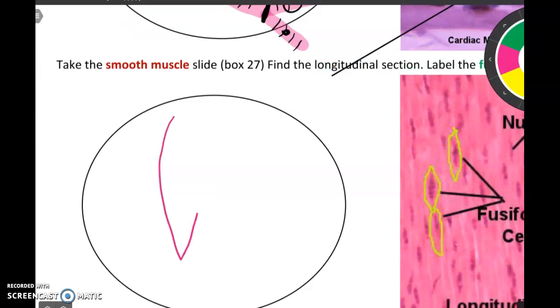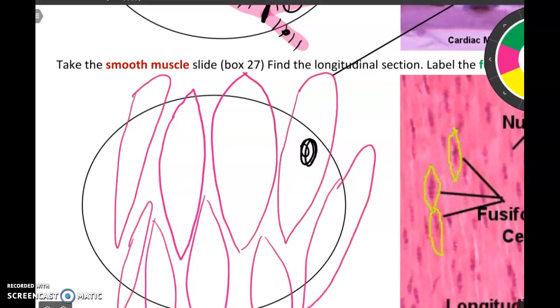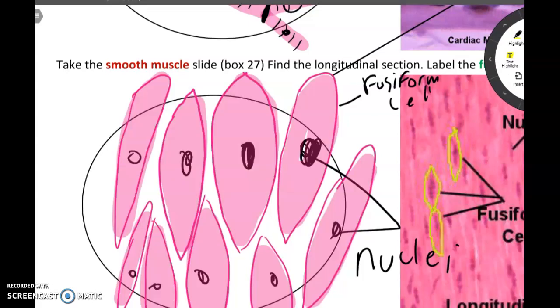Now in the face-to-face class, I tell my students, make your drawings big so you are not drawing that much. Nobody ever believes me. So I'm making these nice and large. So there are these tapered cells with a central nucleus. So there, the central nucleus. And just because that took me 30 seconds, I'm actually going to use the highlighter to color it. And there is smooth muscle.